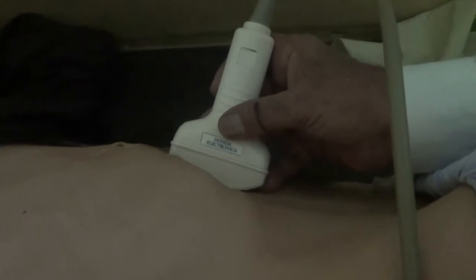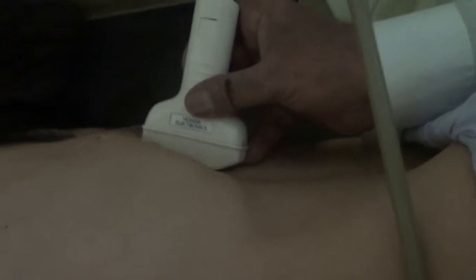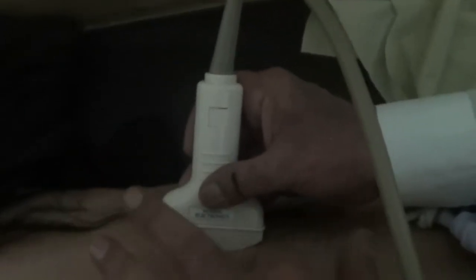This patient is in left lateral decubitus posture and the probe is placed subcostally, angled almost 30 to 40 degrees to get the view of the normal anatomy. With the subcostal region it's making an angle of approximately 40 to 50 degrees. Now let's see what we are getting.